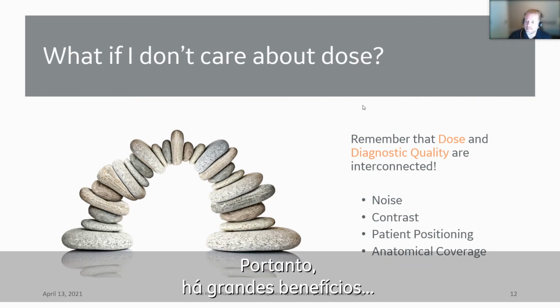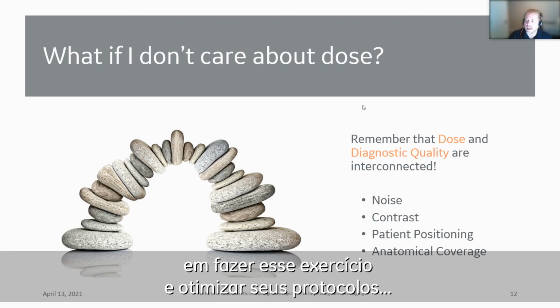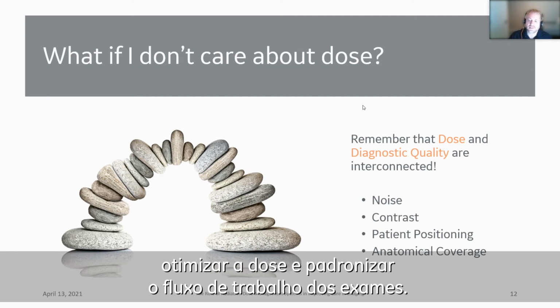So there truly is benefit, even if you don't care about dose, about going through this exercise and optimizing your protocols, optimizing the dose, and standardizing the imaging workflow.